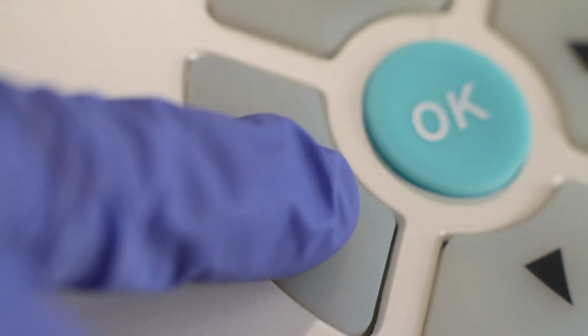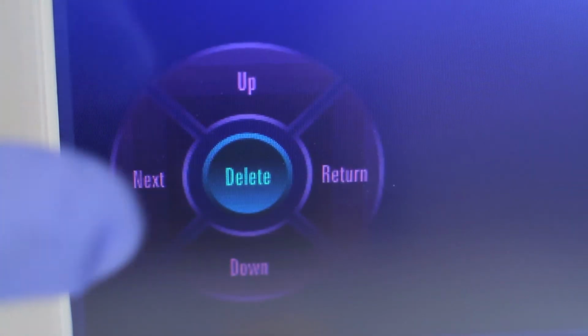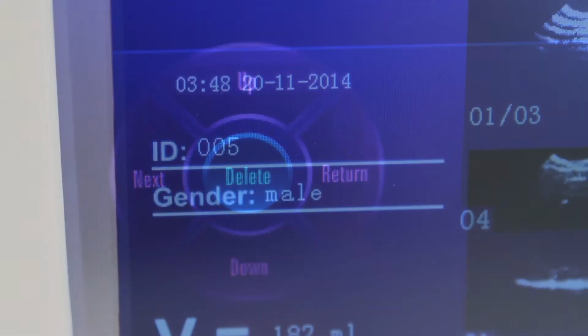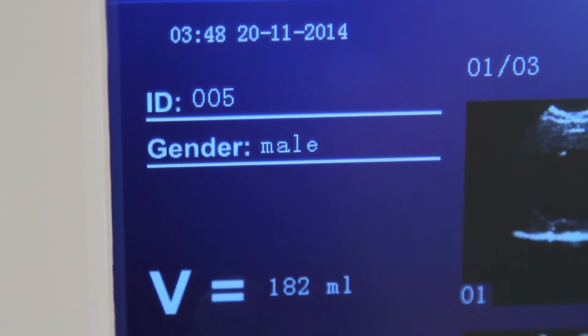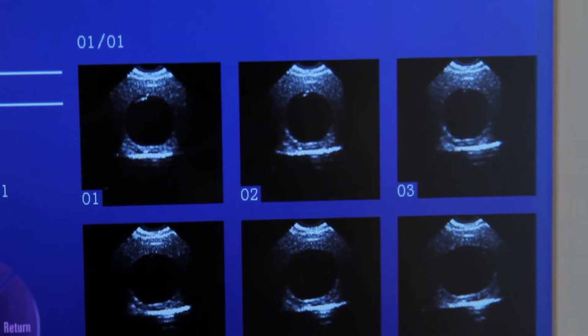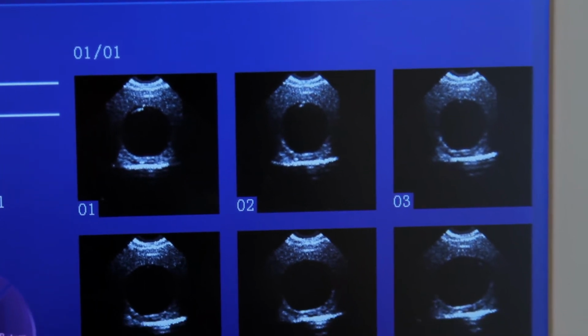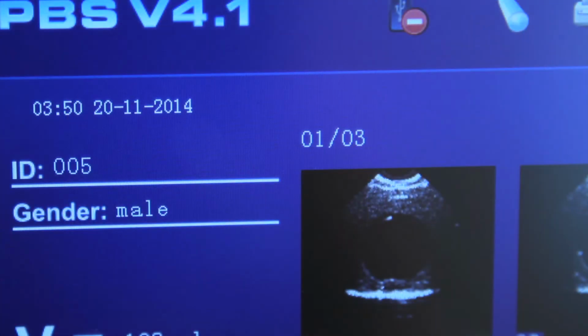To browse historical records, press the left directional key or touch the Browse functional key to enter the Browse Historical Records screen. The screen will display the patient's ID, sex, and measured volume record. The images from past scans will be displayed on the right under the patient ID. There will be 6 images displayed per screen. For example, if 1/3 is displayed, 1 means this is one of 3 total records that have been stored.